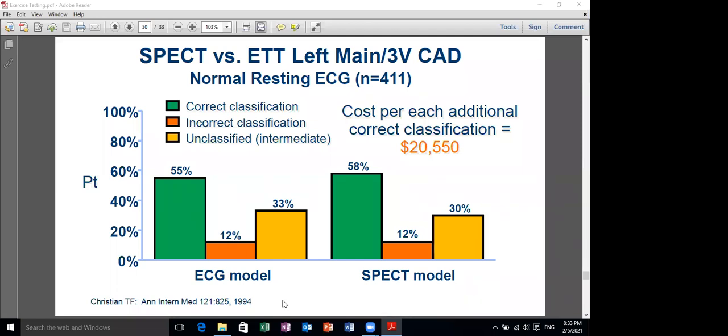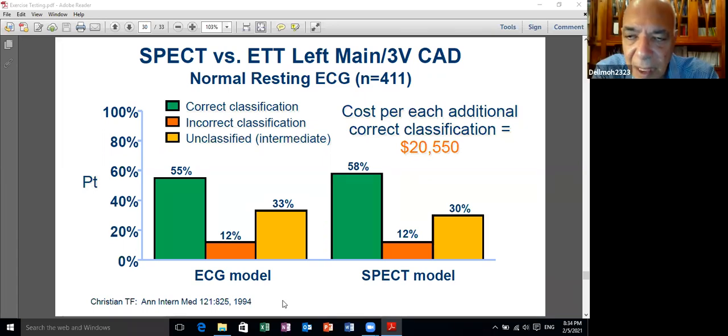اوكي تمام. هو في سؤال بيسأل حضرتك جاوبت السؤال ده. Why is stress ECG acceptable for right bundle and contraindicated in left bundle؟ زي ما قلت ان هو الرايت باندل الاي سي جي از ليفت فنتريكلوجرام.